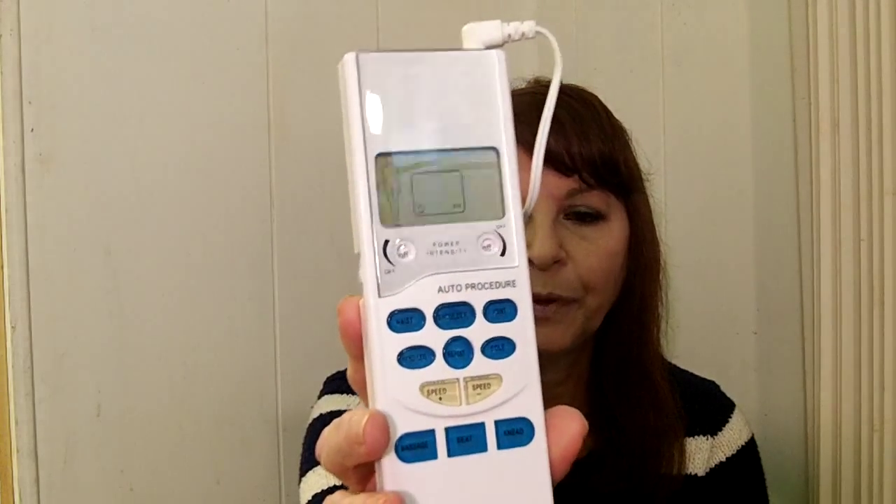Sciatica is kind of a nerve issue — it starts in my lower back and then moves down. I use the Easy@Home TENS pain relieving device on that, and let me tell you, that was awesome. I'm going to show you what it looks like and try to do this video quickly. Here is what it looks like.